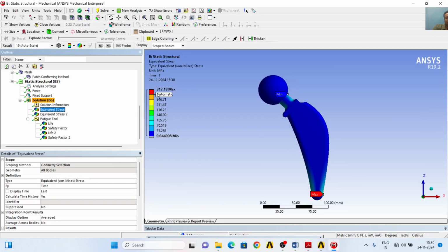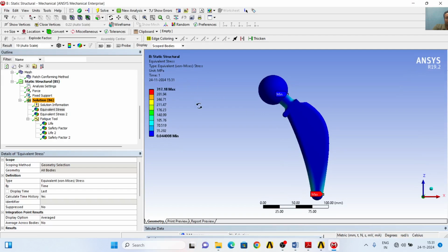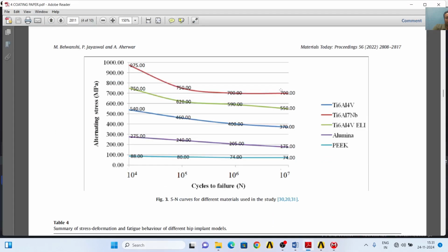For the stem there is 317.18 megapascal of equivalent stress. And from the S-N curve we can see for titanium 6Al4V the limit is 700 megapascal of stress. If any material produces higher stresses than 700 megapascal, it is not going to survive 10 to the power 7 cycles. Here we can see clearly that the maximum stress of 317.18 megapascal is developing in the lower region of this hip implant geometry. So 317 is very well below the alternating stress for 10 to the power 7 life cycles. So titanium 6Al4V is also going to survive 10 to the power 7 life cycles.